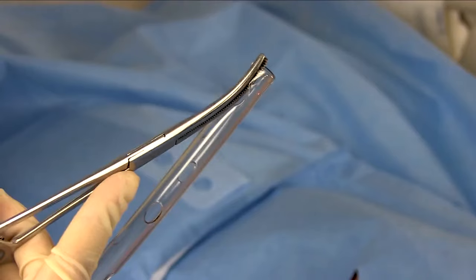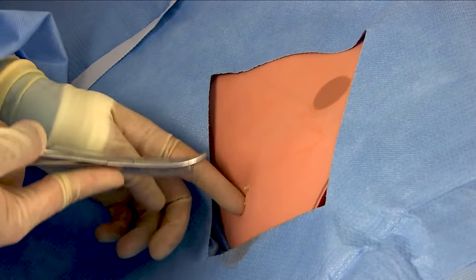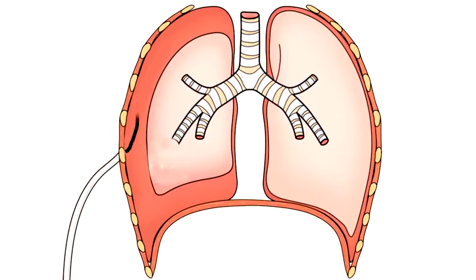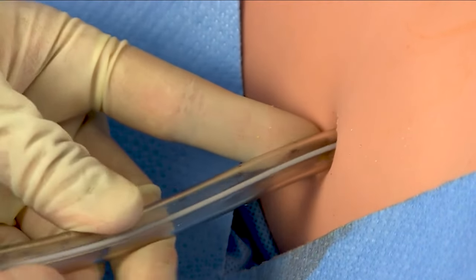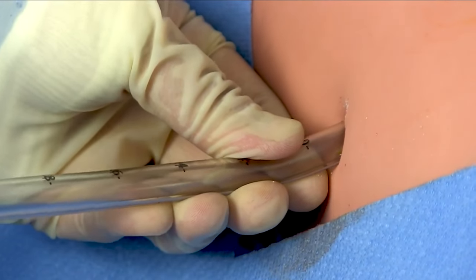Back up the Kelly's so that just the tines are in the hole, then give a generous spread as you withdraw to dilate that tract. Put your finger through that tract and follow it all the way down to the pleural cavity — if you're not in the cavity, you know you didn't make it through the pleura. Sweep the underside of the chest wall 360 degrees to make sure the lung isn't stuck up against the chest wall. Now take the Kelly's and clamp the end of the chest tube through the last hole with the clamps roughly parallel to the chest tube. Use those clamps to guide the chest tube through the tract over the rib. Advance the chest tube until that last drainage hole is all the way in the body, then put it in another three to four centimeters for good measure — you don't want the chest tube slipping out.